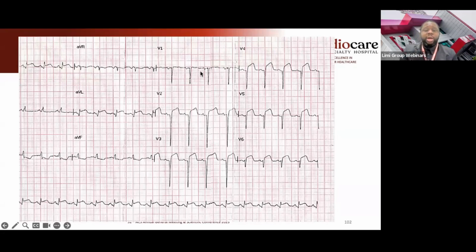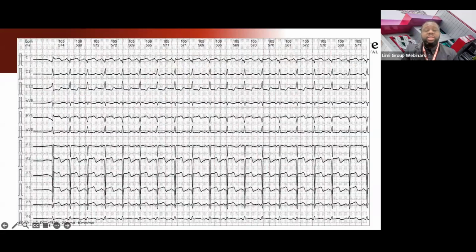So our ECG lectures have been working. For those that have not attended any and are thinking, how can they read ECG? Just go to our YouTube page and listen to them. So this was the ECG from presentation at the referral center. By the time the ECG came, the ST segment had started coming down. Already, he's having a full infarction. Q waves are already forming all the way, meaning that he's having a transmural infarction, straight from the inner wall of the heart through the muscle to the external wall, a full thickness.